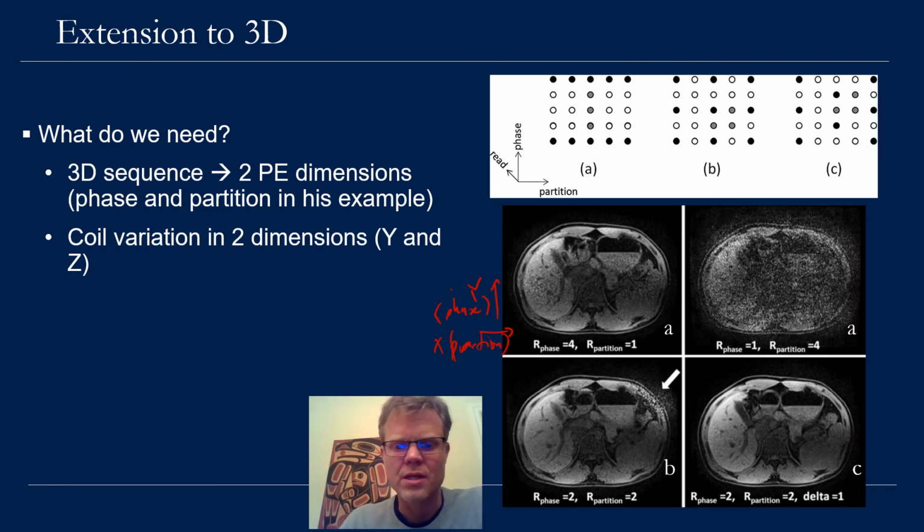Again, we have coil variations only in Y and Z, so actually not in the X direction.